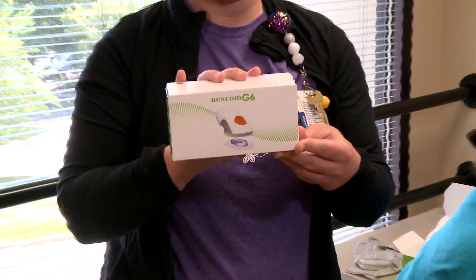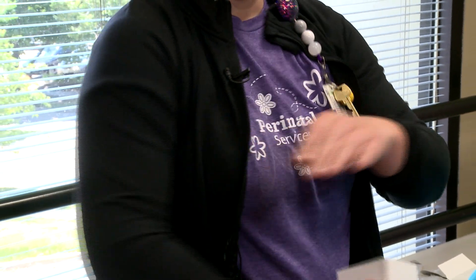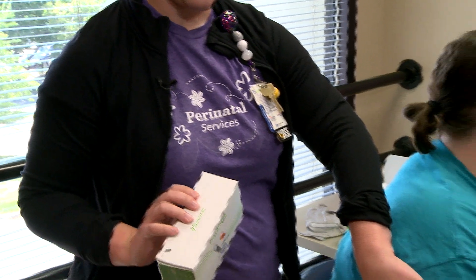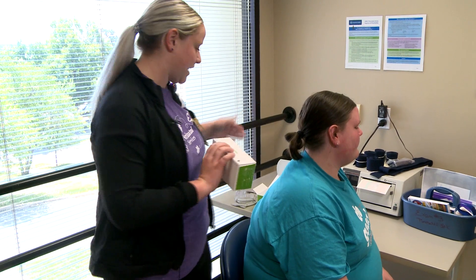Your box comes with this sensor. This will need to be changed every 10 days. We like to place it in the back of the arm, so we're going to go with Shannon's right arm today, and then in 10 days she's going to replace it on the left arm and switch back and forth.